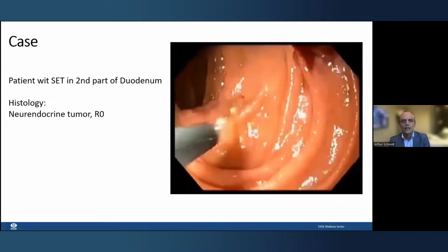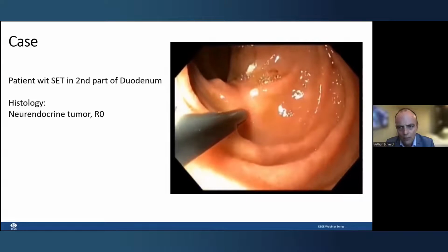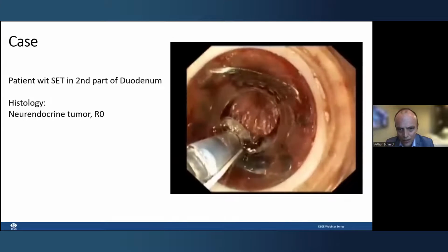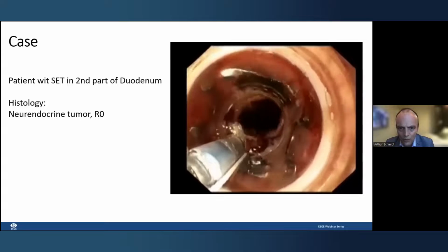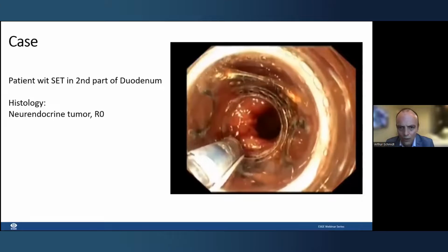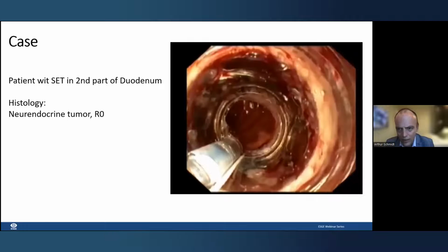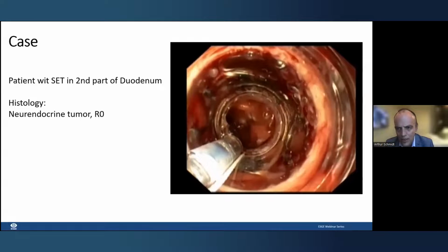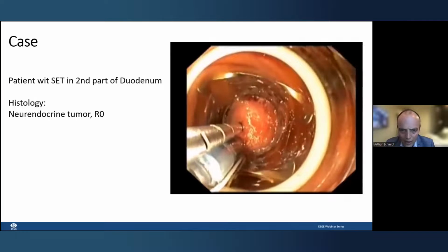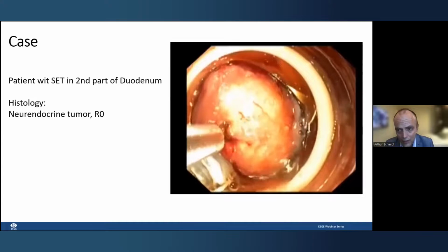This is another duodenal case. This is a patient with a subepithelial tumor with unknown histology prior to resection in the second part of the duodenum. Again, you can see the resection steps, the marking of the lesion, and the device is introduced through the esophagus. We are now in the stomach, and now we reach the pylorus. As I said, sometimes this can be difficult to pass, but usually this works quite fine. If it does not work, you may use the dilation by balloon to facilitate the passage. And then in this case, we used... Actually, for subepithelial lesions, I like to use the anchor device.